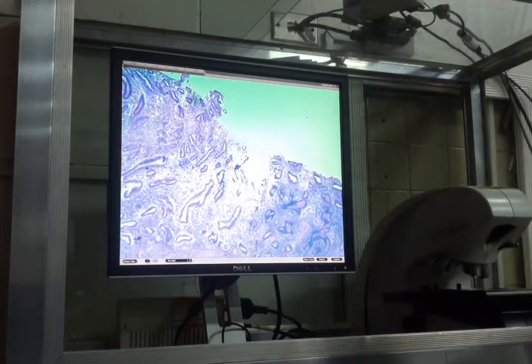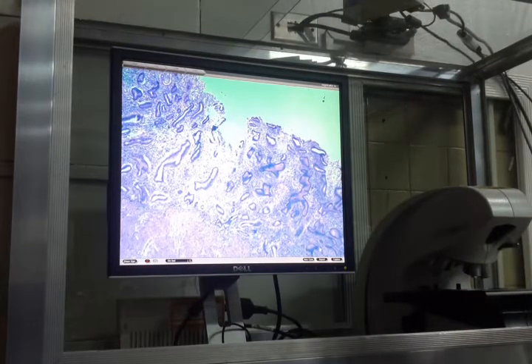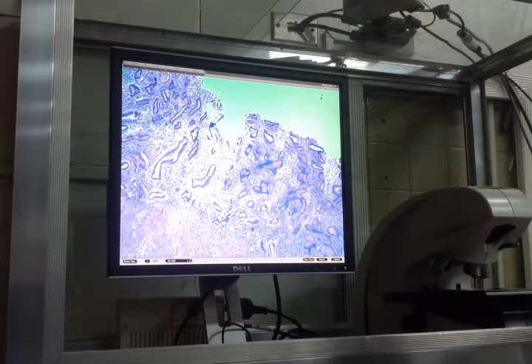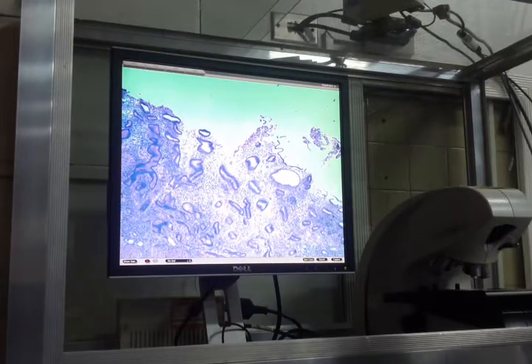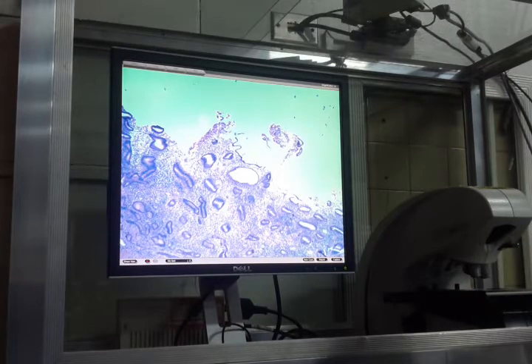Okay. Your laboratory guide labels M1012 as hyperplastic. Tama? Do you have your laboratory guides even with you? It labels this as hyperplastic, but I don't see any hyperplasia. If they're going to use this slide and label it as hyperplastic, they will show you something like this.